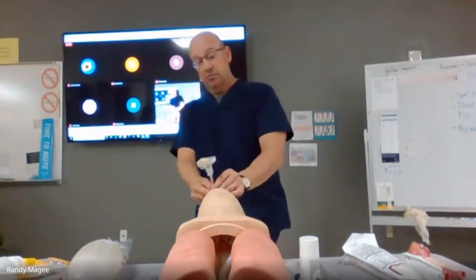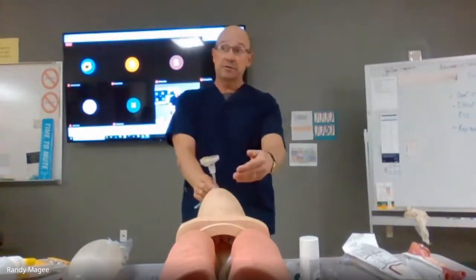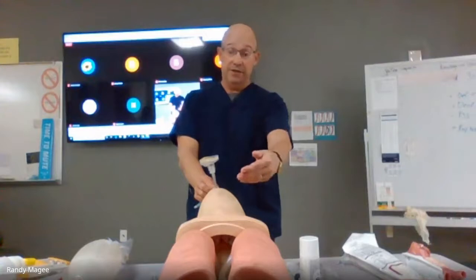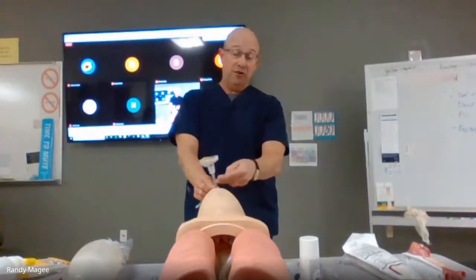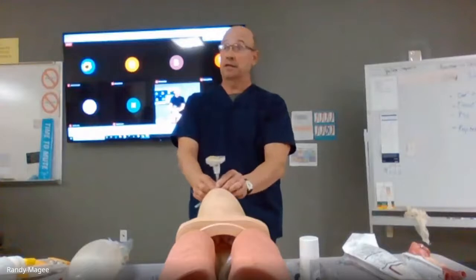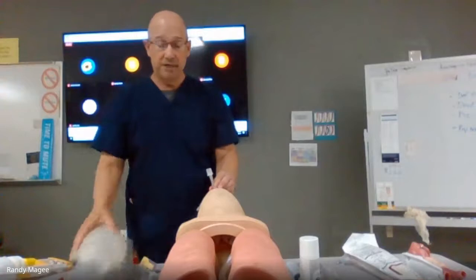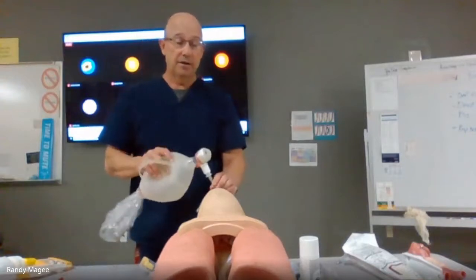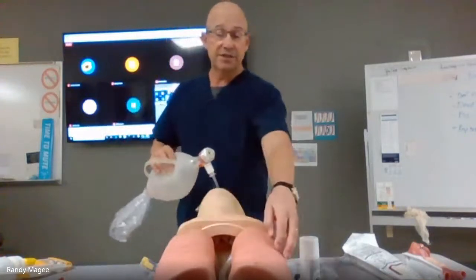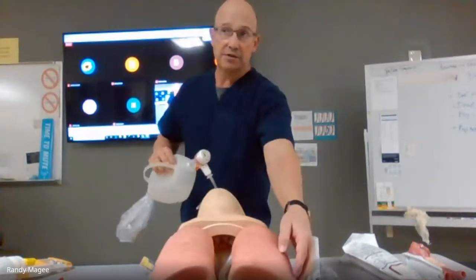The other, when this tube goes in, there's still residual air in the lungs. So this tube is going to fog. I'm going to have condensation in the tube, right? And then the other thing, as you breathe for the patient, I'm going to listen with my stethoscope and make sure that I have bilateral equal breath sounds.